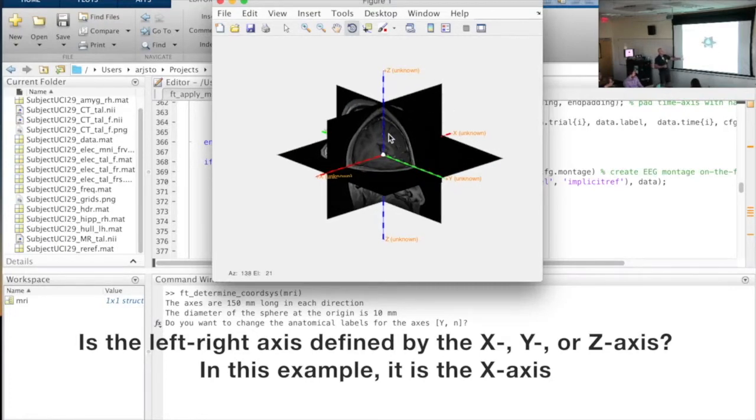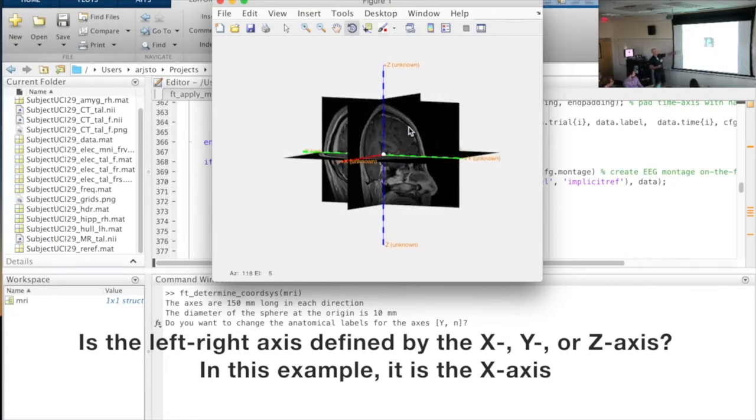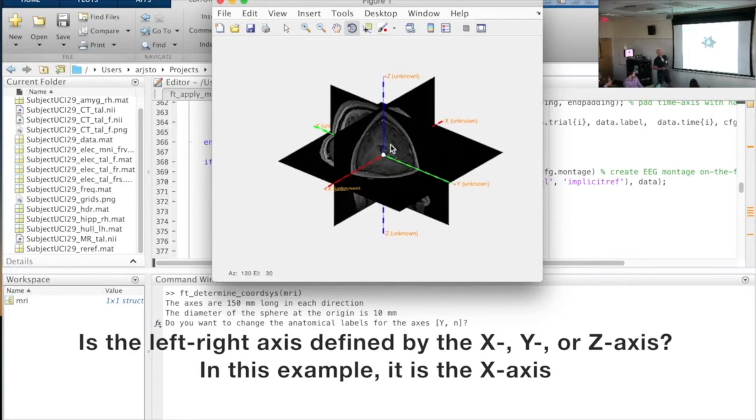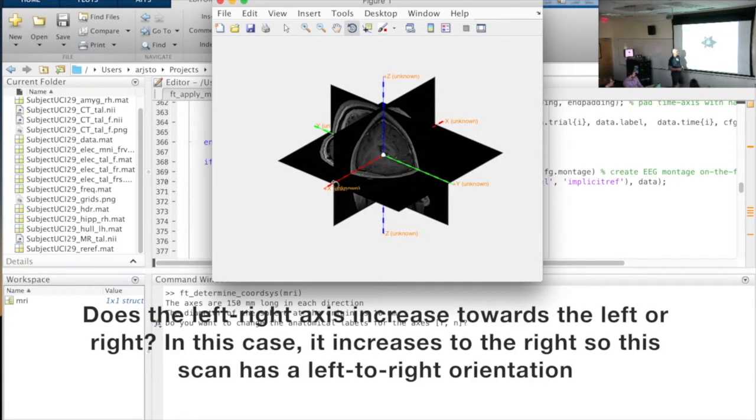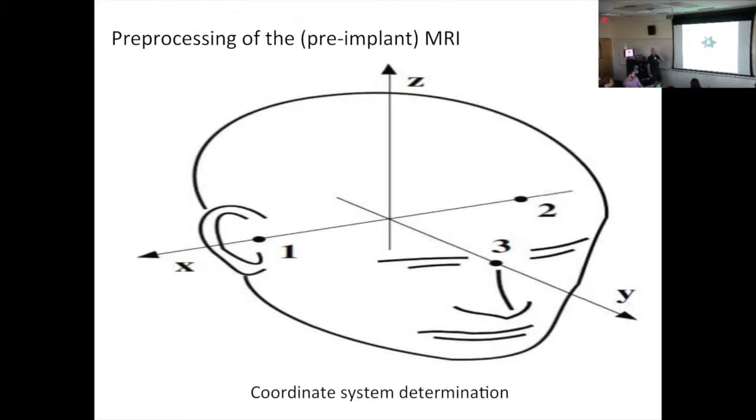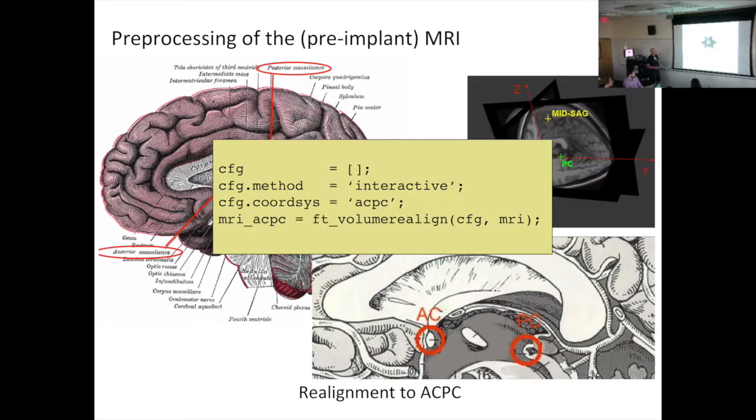And then the third step is, does that axis go from left to right, or from right to left? And the whole reason for doing this is that we want to figure out where the right hemisphere is in our patient, because we are going to align or realign our scan to a new coordinate system. And most of the landmarks that we will be selecting are relatively unambiguous, but the right hemisphere is easy to have a left-right flip. So, we need more context to figure out what the right hemisphere is. I'll show you what that looks like. So, this is our, if you run FT_DETERMINE_COORDSYS, this is the figure you get.